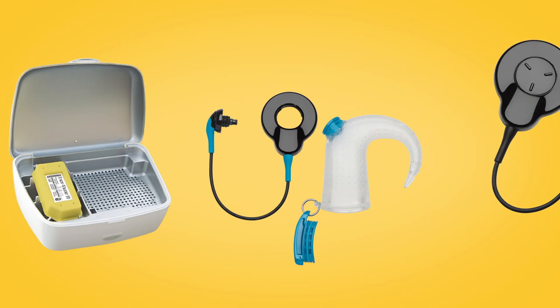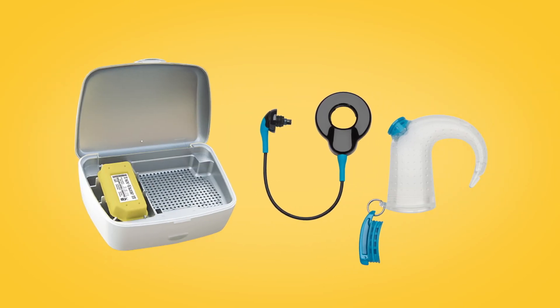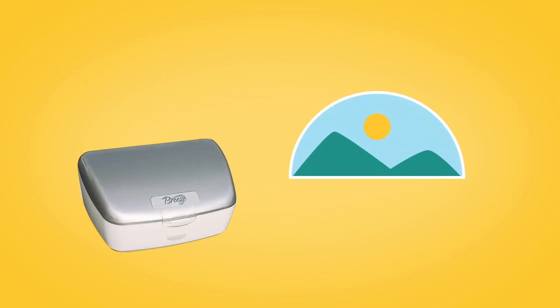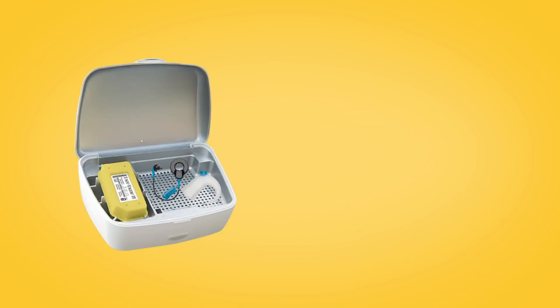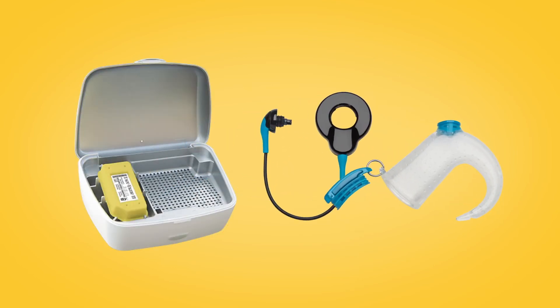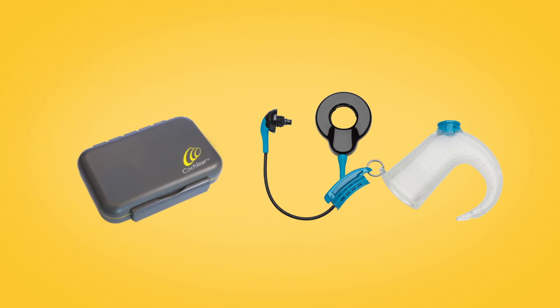You should place Aqua Plus and the blue Aqua Plus coil in your DryAid kit overnight. Then, once they're thoroughly dry, store your Aqua Plus system in the Nucleus 7 Activity Kit's waterproof case.